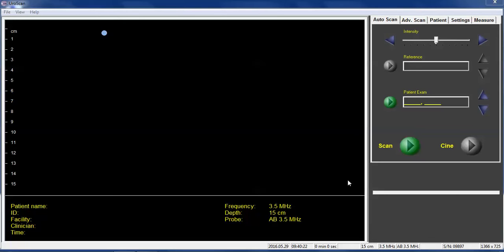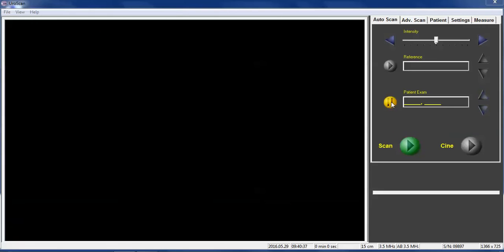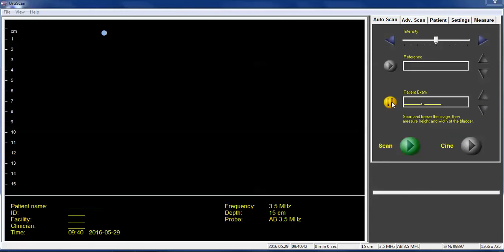To start, I'm going to begin a patient exam by pushing the green play button next to the patient exam box here. That's how you start an exam with a patient. So just push the button and it'll turn into a yellow pause symbol. You'll see yellow text below the patient exam box where it says to scan and freeze the image and then measure the height and width of the bladder.